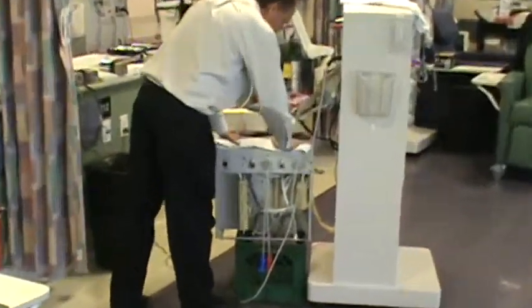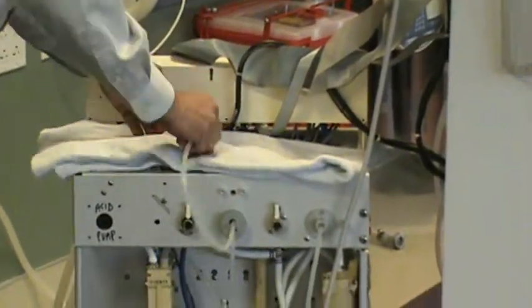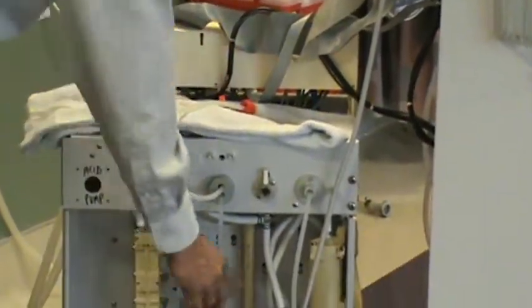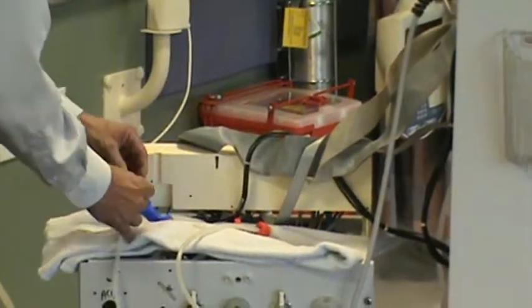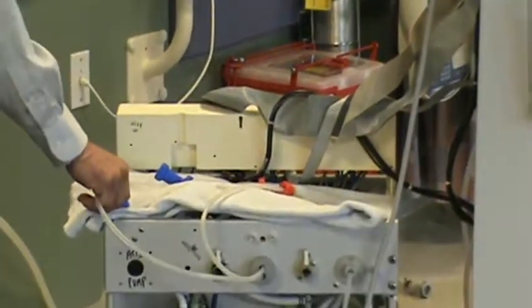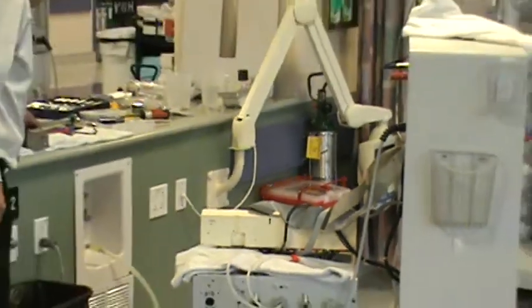I start by putting a clean towel on the top of my machine and opening up the acid spike. I remove the old o-ring and filter and throw them away. Then I remove the bicarb handle, throwing away the old filter, and I notice there's a little debris on this filter. I make sure that these are clean as I'm doing that.